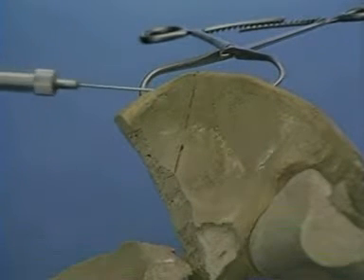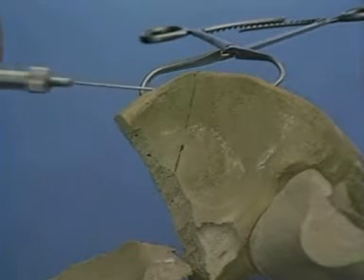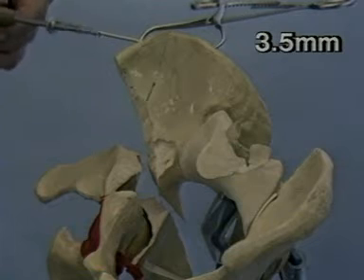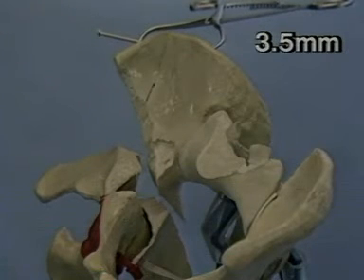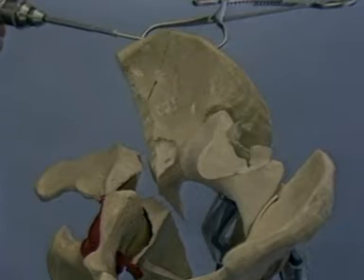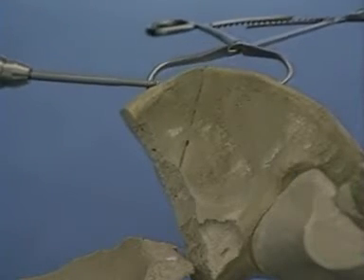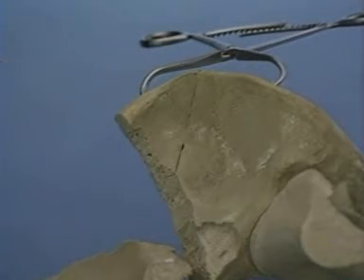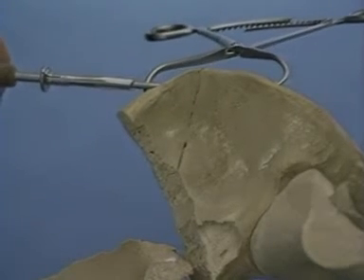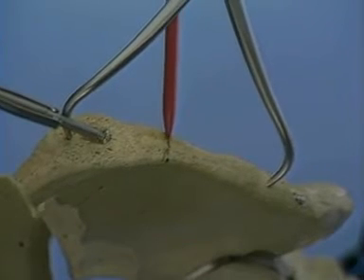The depth is measured and the screw inserted. The screw crosses the fracture line and exits the crest of the ilium.